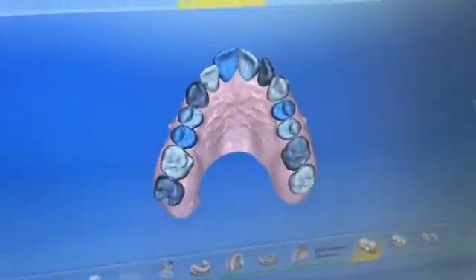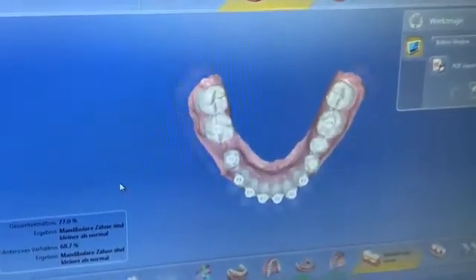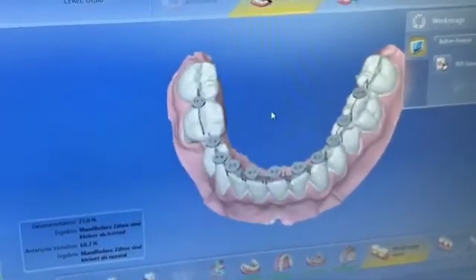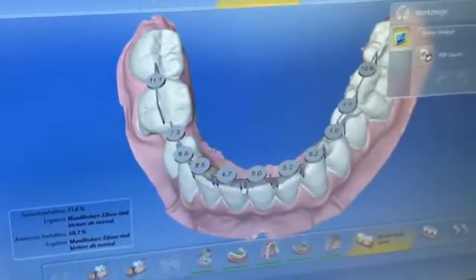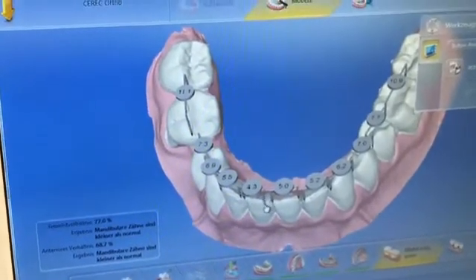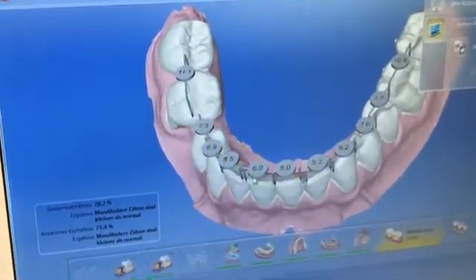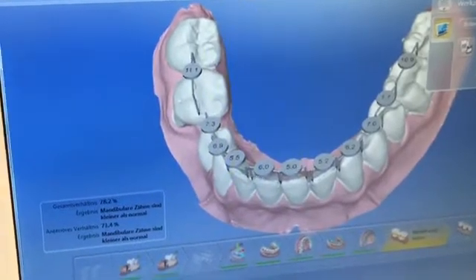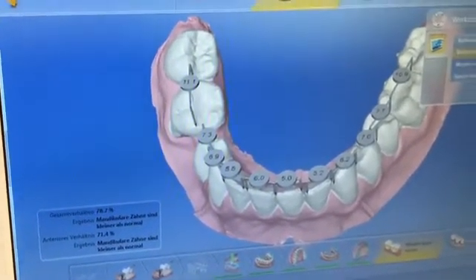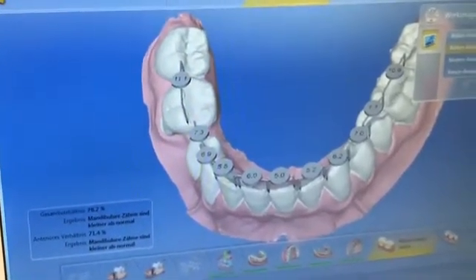If it looks good and the same thing in the upper jaw, then the computer calculates the tooth width and it shows you exactly how the teeth are. Of course you can adjust this also — you can move around here. This is the Bolton analysis, which is a tooth width analysis for upper and lower jaw.